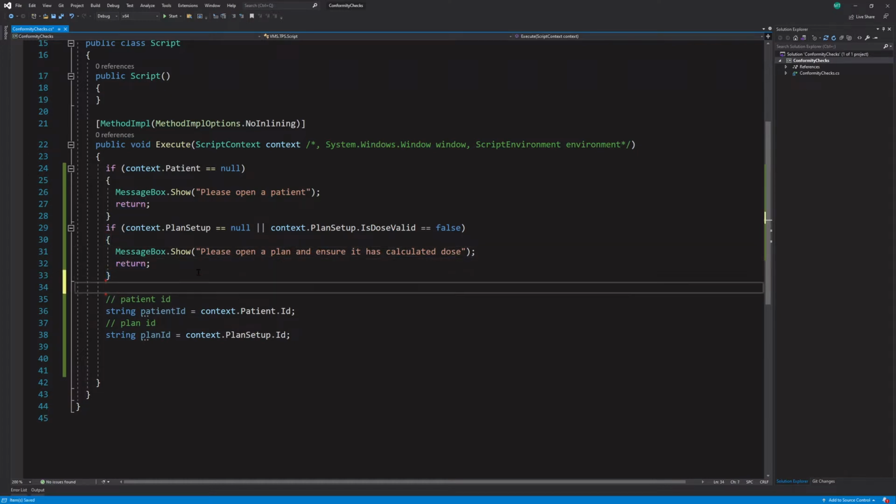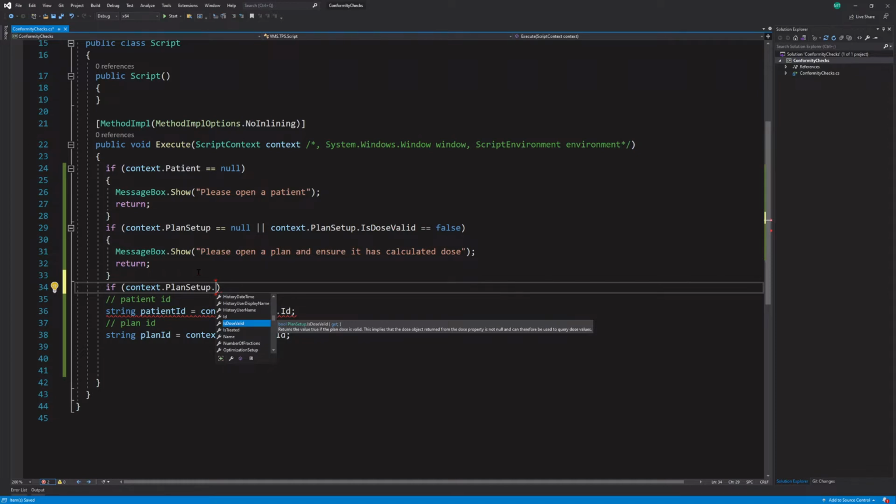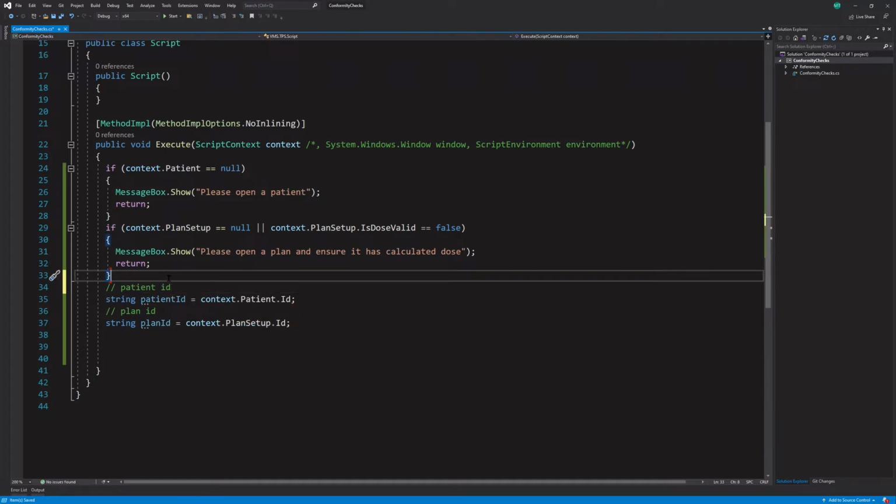Then there's another thing that we need to check for, if context.PlanSetup... well, you know what, we're going to do this in relative anyway. We don't need to know the absolute dose, so we won't worry about that. I was going to say we need to check that there's a dose per fraction. Well, we actually do need that, because otherwise it wouldn't know what 100% is. Well, would it? No. If dose is calculated, if you've optimized a plan, you have to have a dose and dose per fraction. I'm pretty sure you need both. So we'll come to that if we ever see this script crash for some reason that we don't know, and then we'll figure that out.